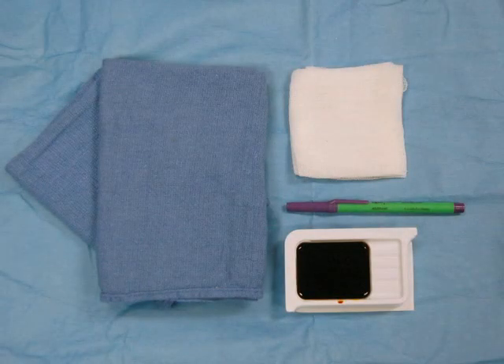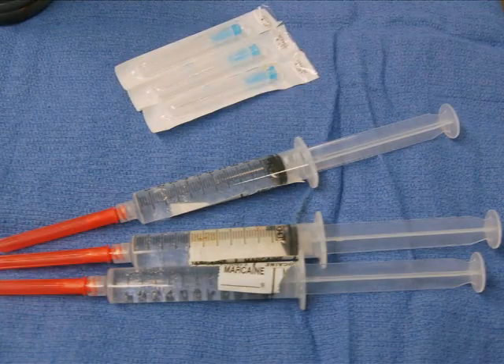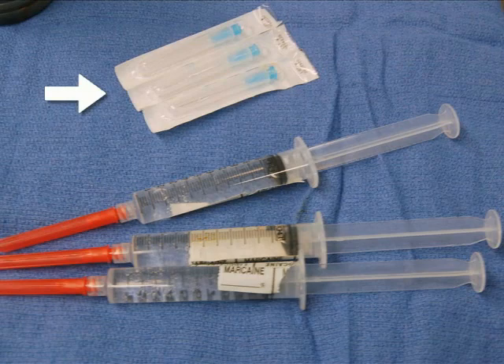Lay out all necessary equipment prior to performing the ankle block. Sterile towels, 4x4 gauze, betadine, and a skin marking pen are used to prep and mark the foot prior to the block. Also obtain three 10-milliliter syringes, three 25-gauge, 1½-inch needles, and local anesthetic.